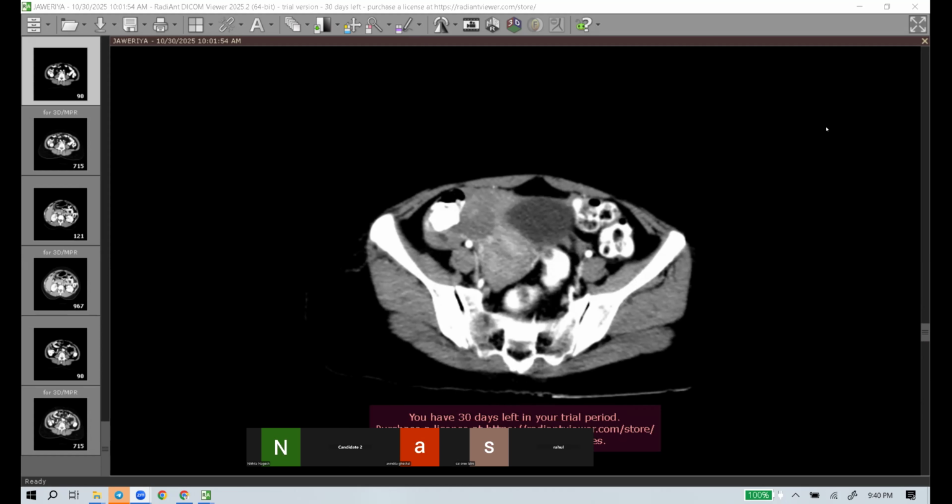is any history of missed period, whether they have done any suspicion of ectopic pregnancy. So in that case, I would like to confirm my findings with an ultrasound to look for any obvious sac-like structure or any hematoma in the right adnexa, and I will confirm the finding to the treating physician.